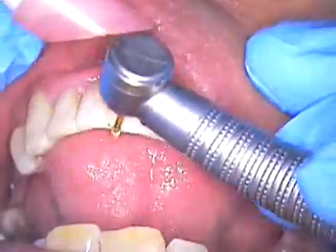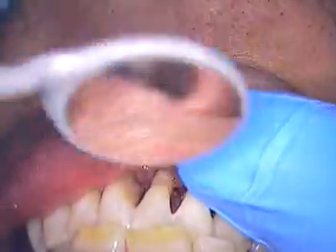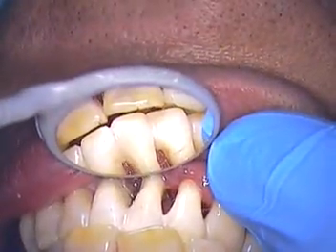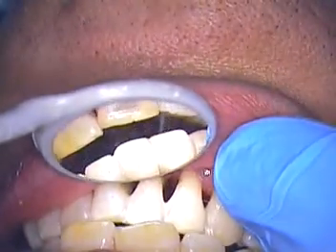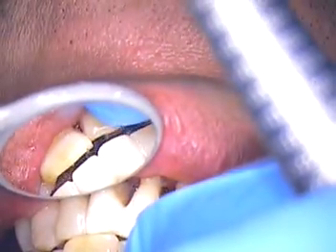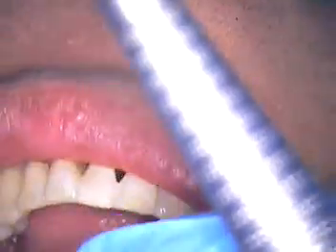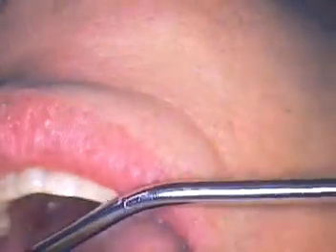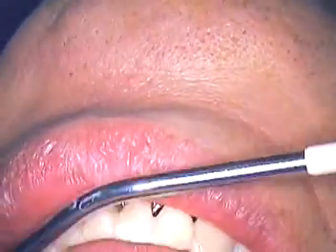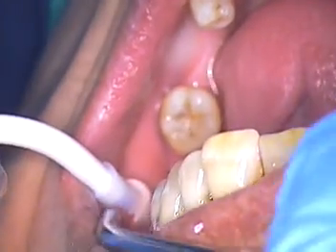And we'll make some adjustment on the back. Bite down together. Hold it right there. Now slide forward and backward, forward and backward, all the way. Touch my finger out here with your bottom teeth, like you're coming out to bite something on your front teeth. We'll turn that off — let me turn it off. Don't move. We got that suction tip. Going over time. Is it stuck? Let me put a little water on that and see if I can pull it out.